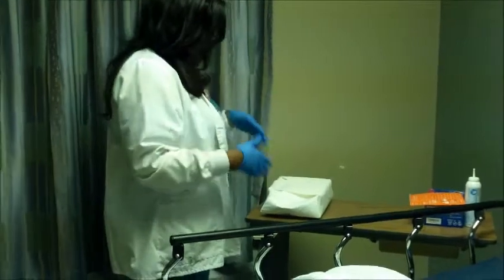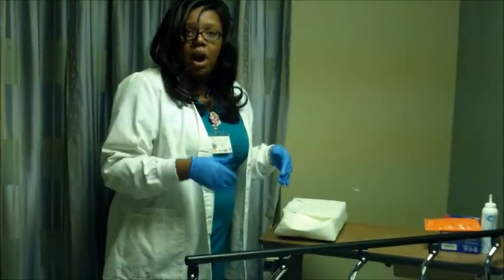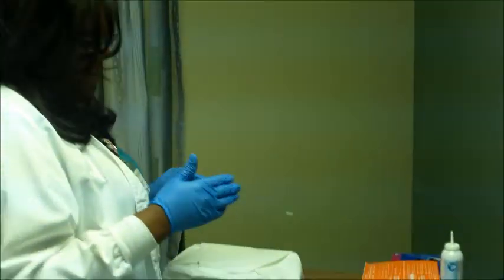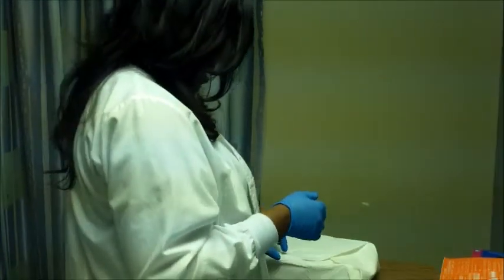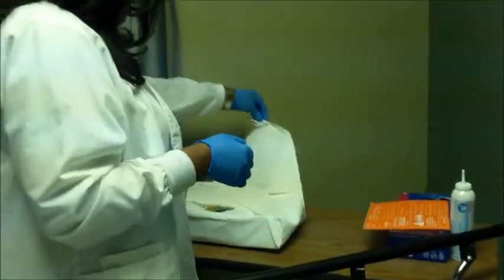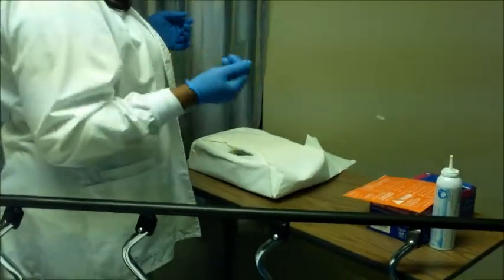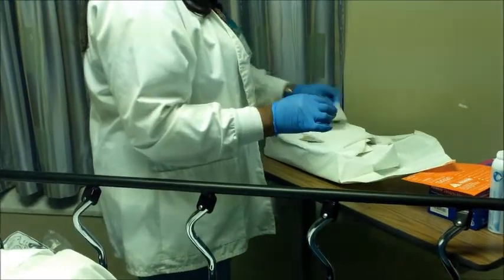Okay, starting now, I want to make sure I open the kit away from me, so I want to turn it around. I just want my sterile field. Keep in mind it will have a 1-inch border, which is considered contamination, so I want to keep that part in mind. I want to open up the kit away from me, and to prevent crossing over, okay.